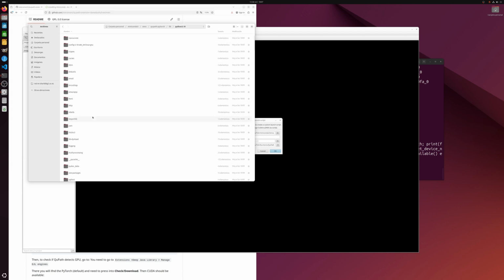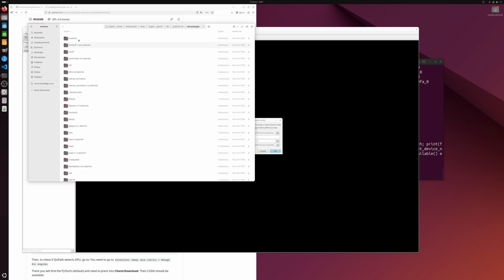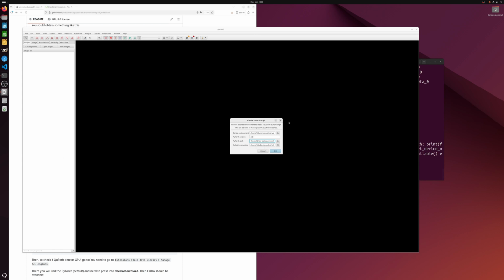Okay, we are here now, site-packages, and then we need to go to torch. Okay, to torch, and we copy this path over here, we close this over here and paste the path.